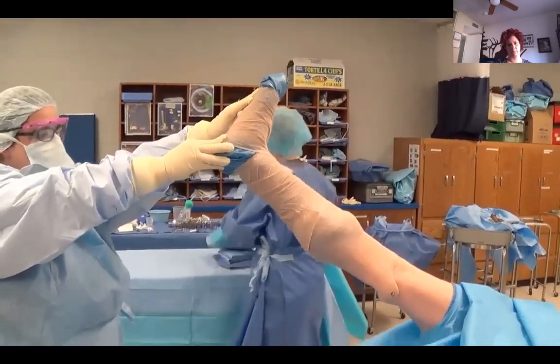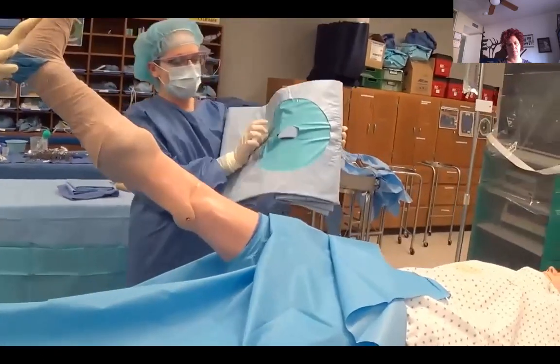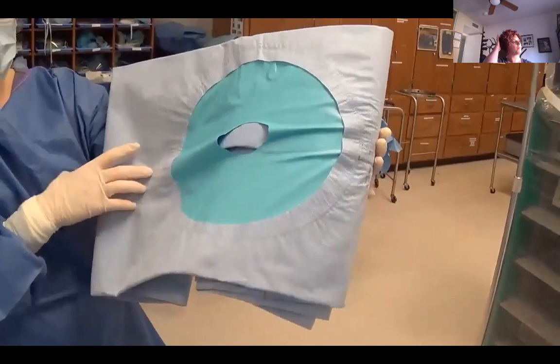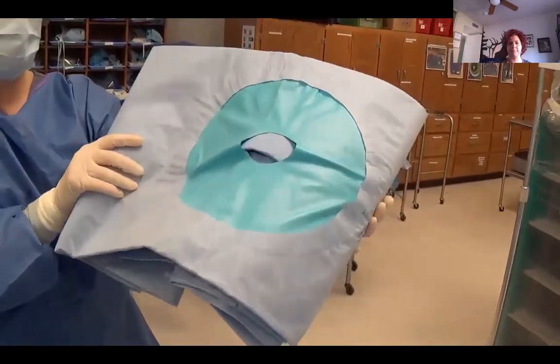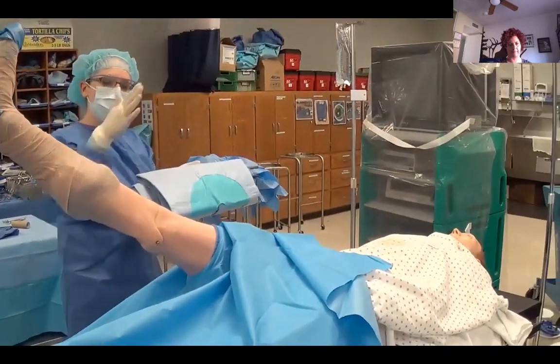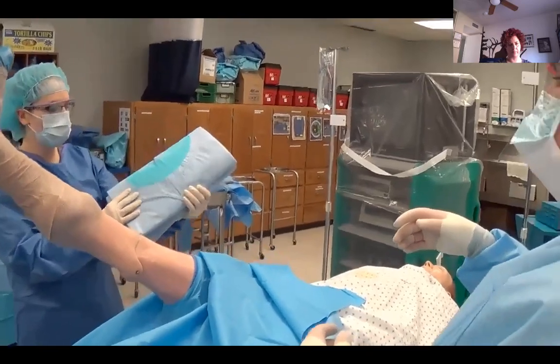The next sheet that we're going to put on is called a lower extremity sheet. So you can see it has a stretchy type of a circular fenestration here, which is going to be different than our laparotomy sheet, which just has the cutout in it. Okay. So on this one, the extremity is going to go through the sheet. So we need to open it above the extremity, not underneath like we did with the impervious split sheet.